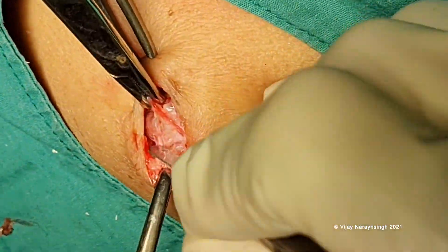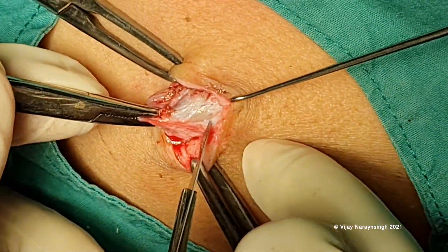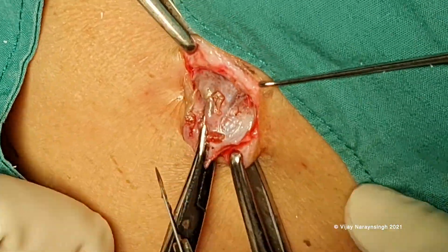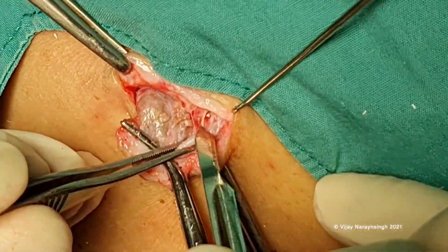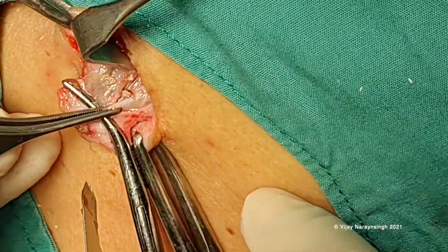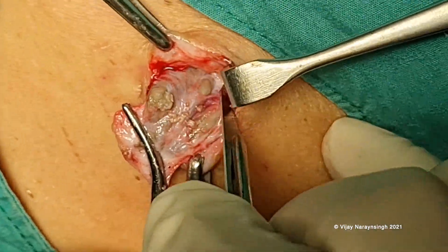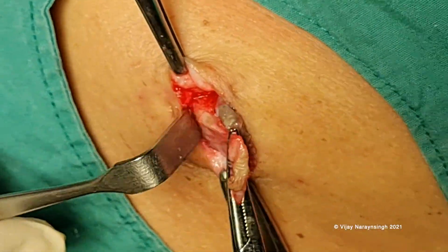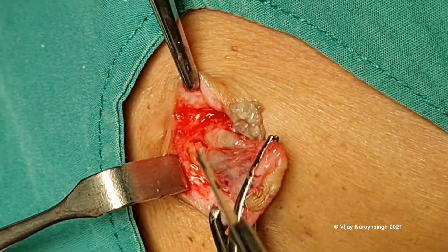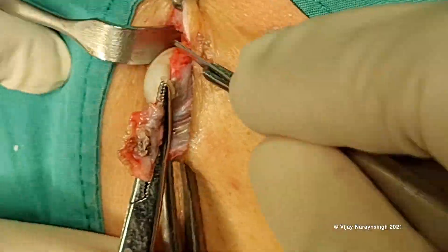However, we were able to dissect it out, and if ever a part of the cyst wall ruptures, what we will do is continue the dissection outside of and deep to the wall. Here we are doing that, getting around that thin, very thin portion, and getting the entire cyst wall out. Here you can see the tearing of the cyst, but it's quite superficial and it doesn't affect our dissection, and we achieve a complete excision of the entire cyst wall. Here you can see how thin walled it is in some areas.